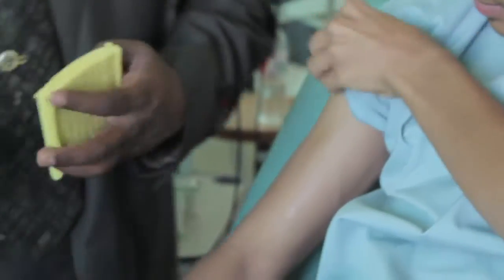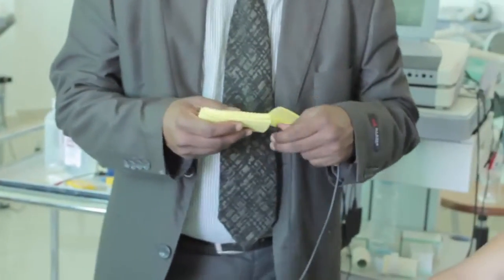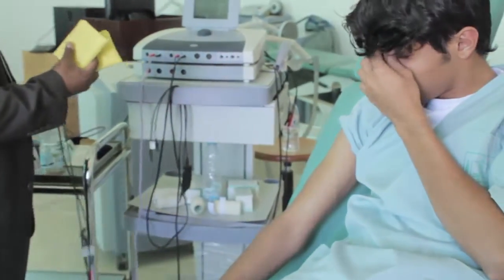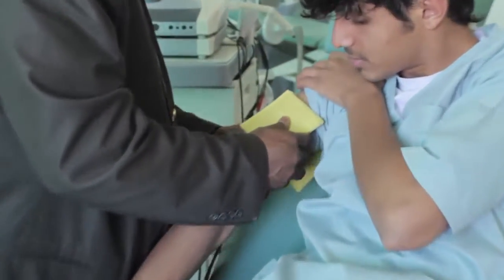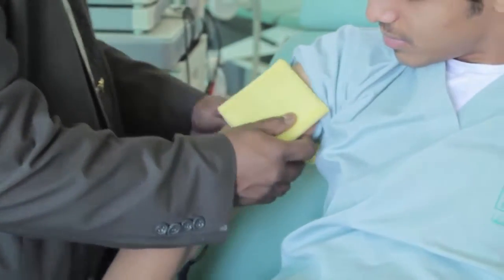Once you prepare the skin properly, then keep the electrodes in position. So here the position is opposite to opposite. Cathode and anode are opposite to each other.